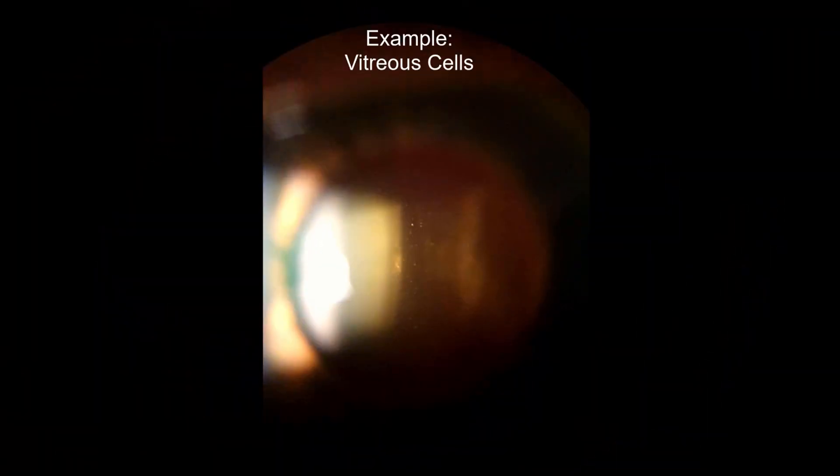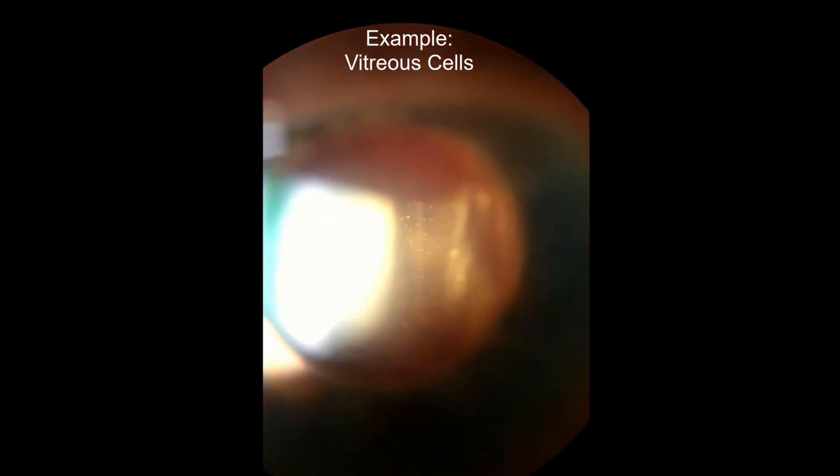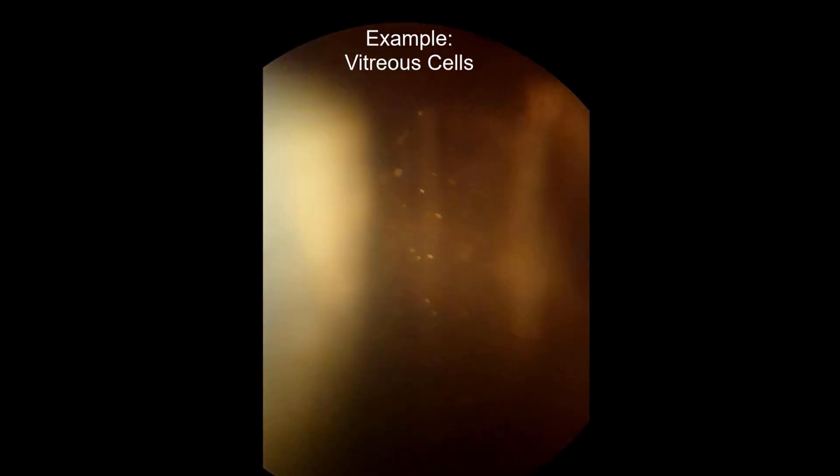If you shorten the height of the beam and use about a 45 degree angle, you can examine the anterior chamber. You can also focus further back into the vitreous to look for cells or tobacco dust.